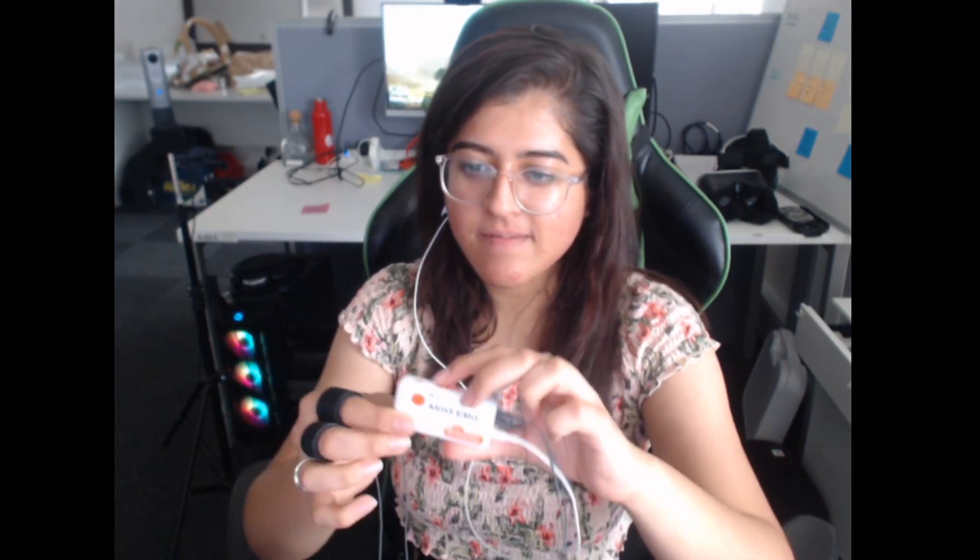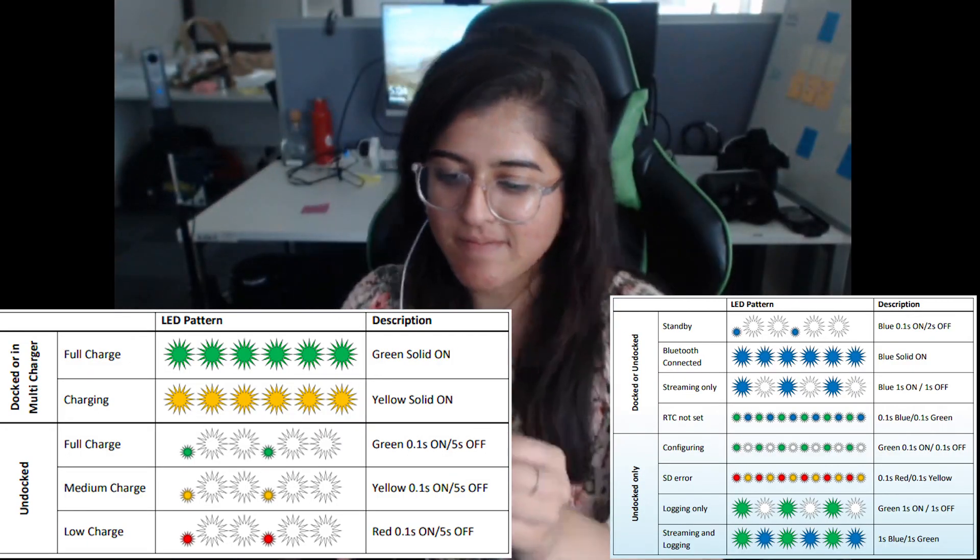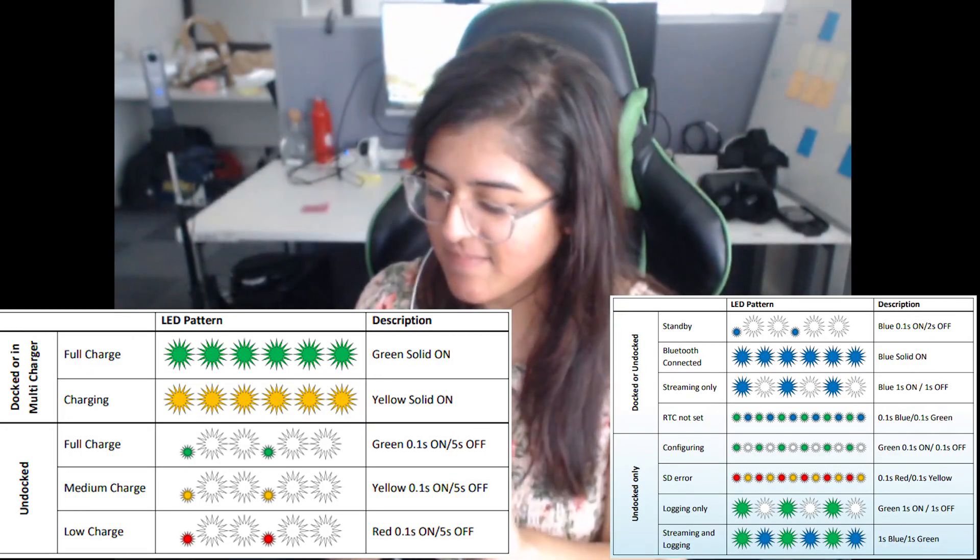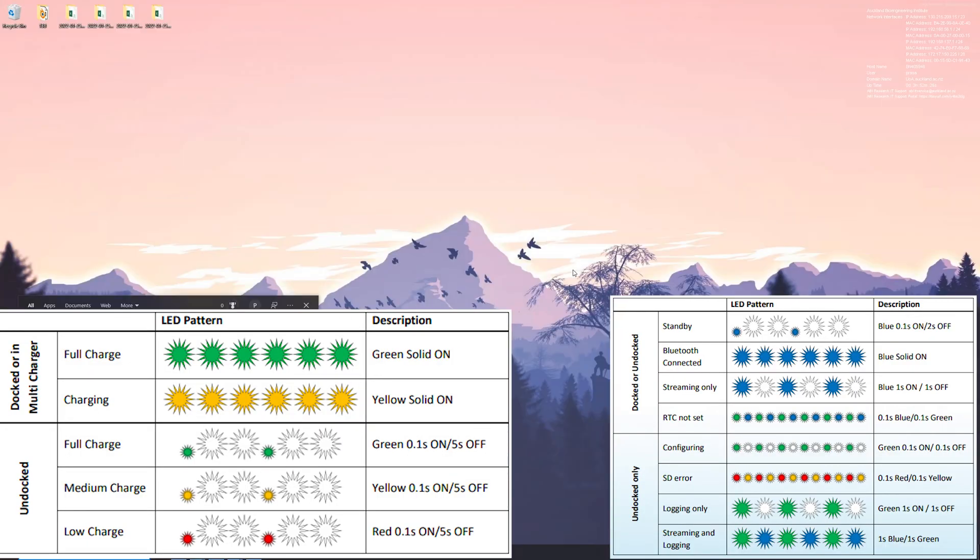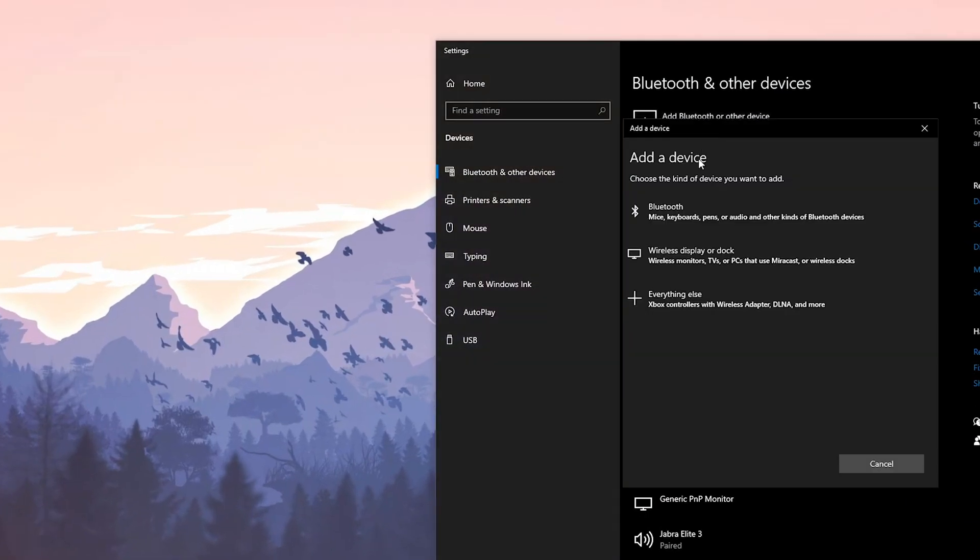The LEDs indicate the connection and streaming status. In the Windows machine, add a new Bluetooth device and search for the Shimmer.